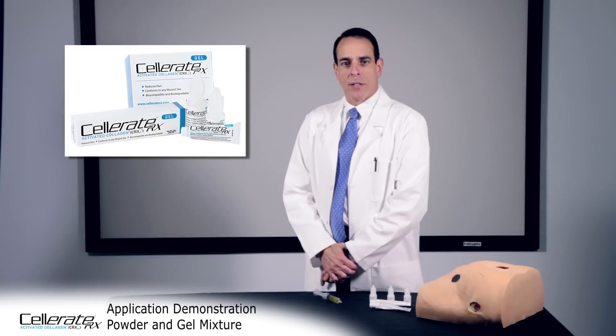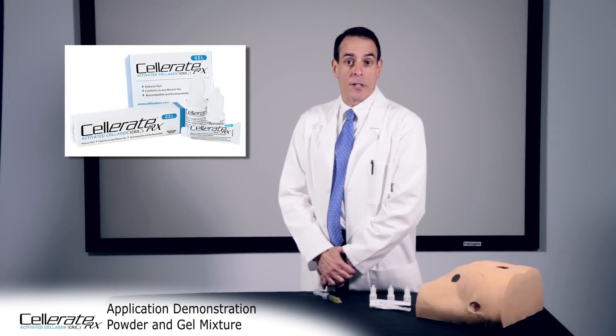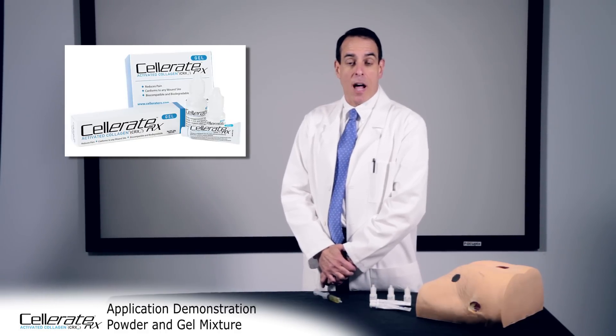Celerate RX gel and powder is the only FDA cleared type 1 activated collagen on the market. Activated collagen is immediately available for the body to use.